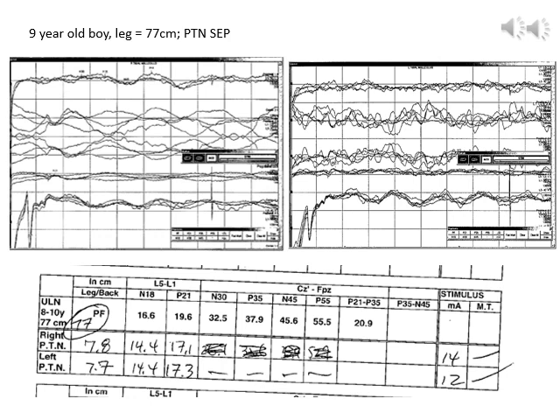Now, when we look at the tracings, they're clear and they're reproducible. However, the cortical responses are absent. It's not certain that there are lumbar responses, but the popliteal, the peripheral responses are clear. And so there's a clear popliteal response, and this is noted in the table as well: possible lumbar responses, and absent cortical responses.